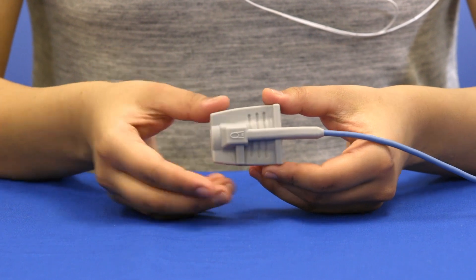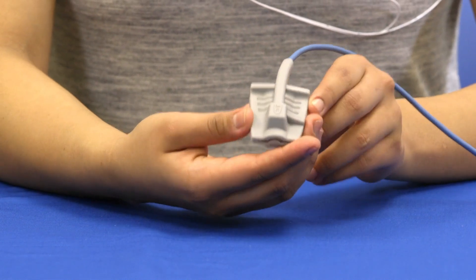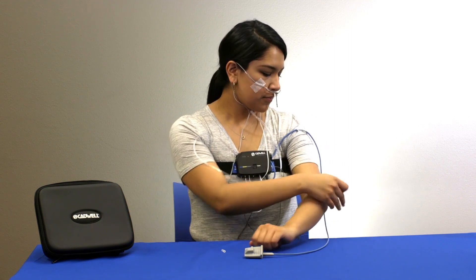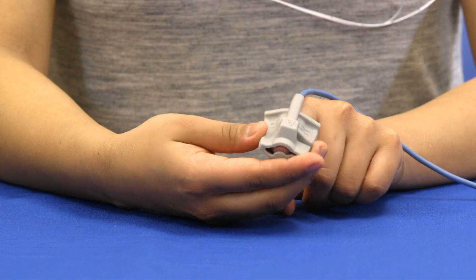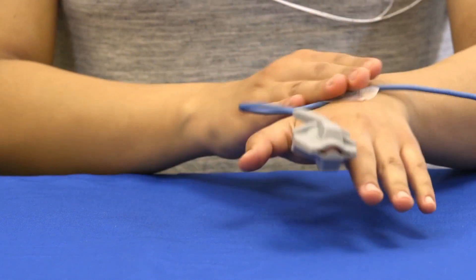Place the oximeter finger sensor on the index finger of either hand with the cable running over the back of your hand. Your finger should go to the end of the sensor but not through the cutout at the end. If it is too tight on the index finger, choose a smaller finger. If the cable hangs loosely, tape the oximeter cable to your shoulder and elbow. If there is no slack, tape it just to your hand. Close your hand into a fist, then tape the cable to the back of your hand. Do not wrap tape around your finger, as this will restrict blood flow and reduce signal quality.